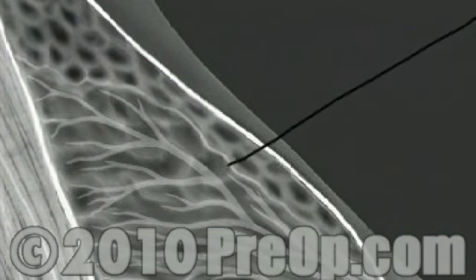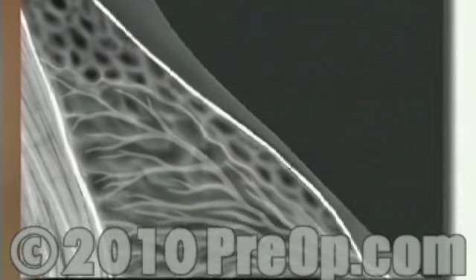Once the specimen is removed, the doctor may have it X-rayed in order to determine whether or not the correct tissue has been removed. Very rarely, the doctor may decide, based on this X-ray, to remove additional tissue. Your doctor and nurse will remove the guide wire and close the skin over the incision as neatly and as cosmetically as they are able. Finally, a sterile dressing is applied.